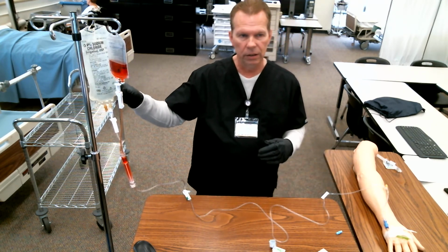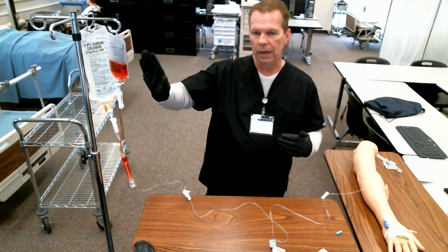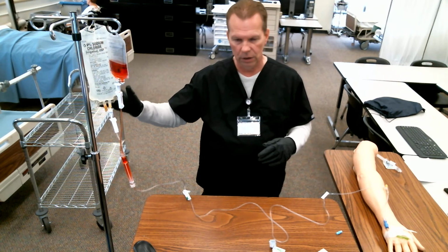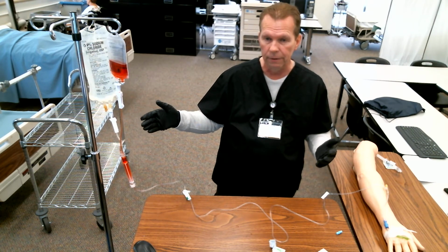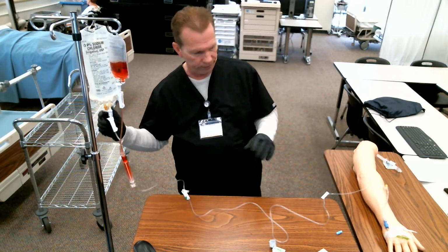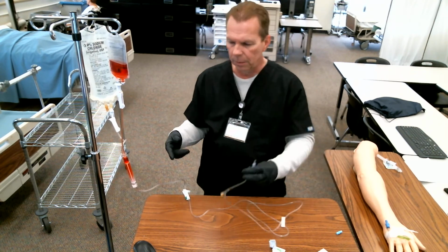I'm not going to let this whole bag run in. Absolutely not, because this is going to be taxing enough on the patient's body. Fluid volume overload becomes a potential threat there. So we want the blood to go in. We don't want much of this saline to go in at all. Basically, the saline is just to prime the line and keep the blood from sticking to the sides of the tubes. So once the blood gets all out of the tube, I'm going to shut the whole thing off and disconnect.